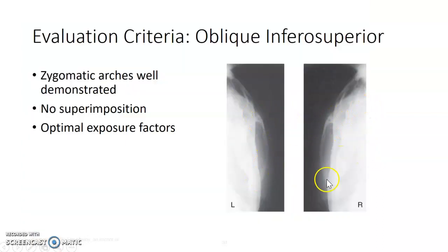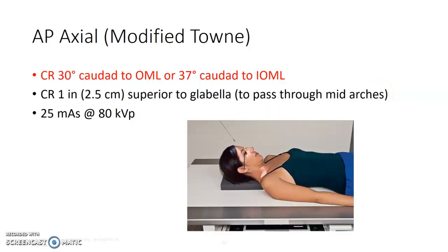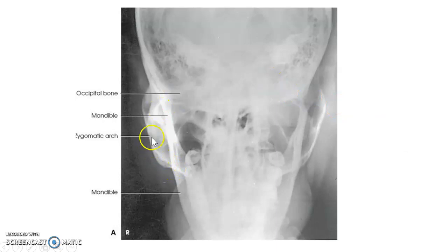You want the arch open and not superimposed — a beautiful image shows it nice and wide open. There's also a modified Towne view, really similar to the skull Towne, except the central ray enters one inch superior to the glabella and passes through the mid-arches. Here you can see the zygomatic arches clearly on both sides in a well-penetrated image.